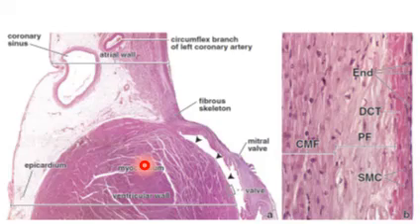The left ventricle is 3 times thicker than the right ventricle, because the left ventricle pumps the blood against a very high pressure, I mean the systemic circulation. Those arrowheads indicate the endocardium, the most inner layer, and the valves and fibrous skeleton will be stated in the second objective of our lecture.